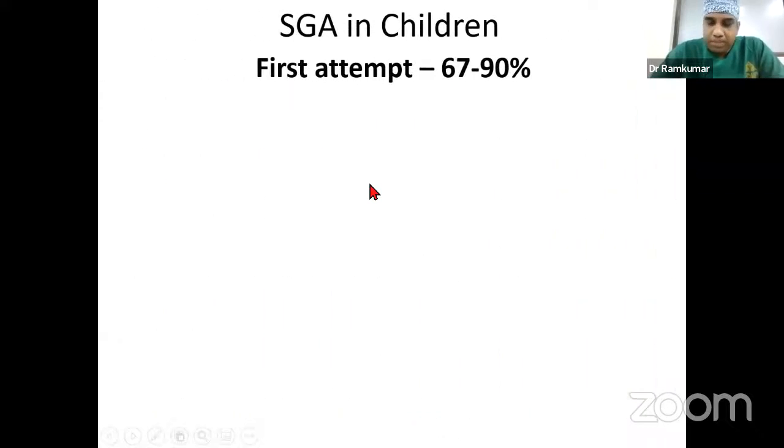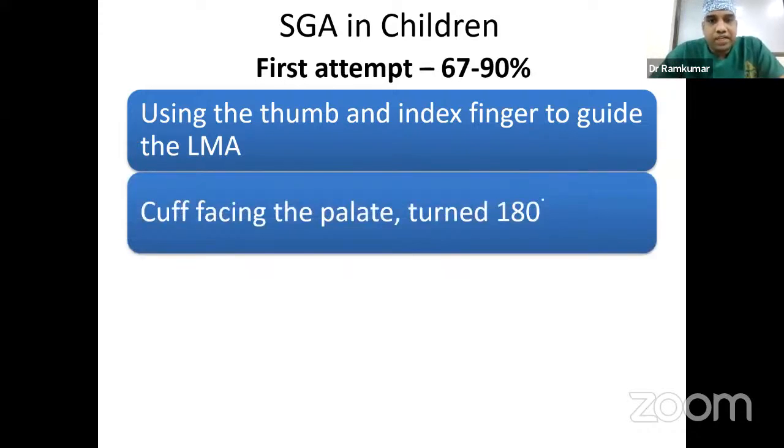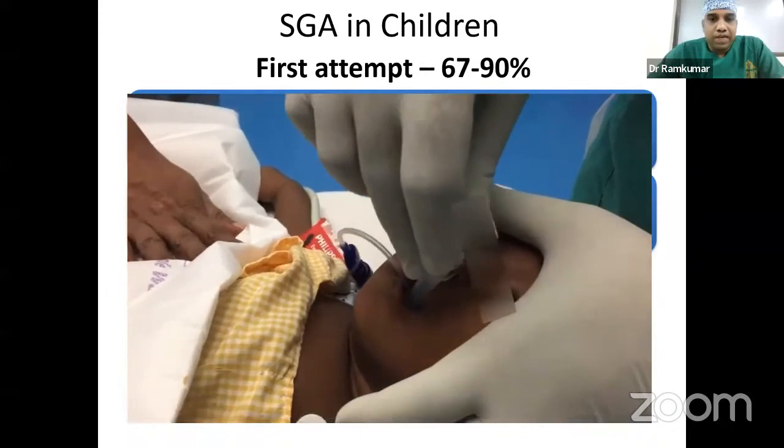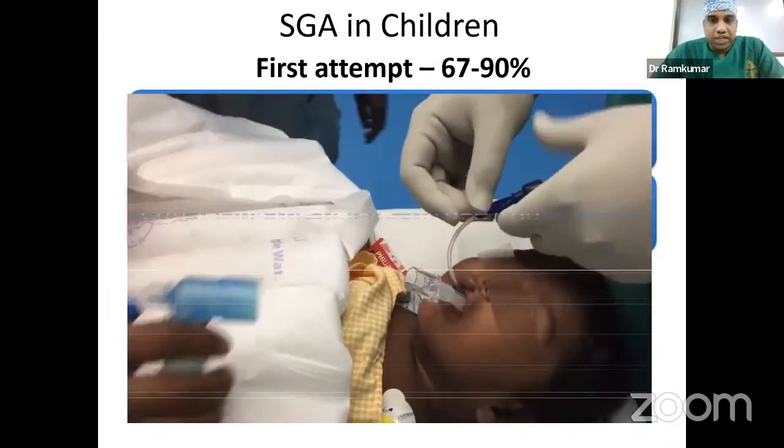Coming to use of the device in pediatric populations, generally the success rate in pediatric populations varies around 67 to 90%. The techniques are the digital insertion technique, which I showed already. The other technique is needed because the problem with pediatric ventilation is that the tongue tends to move backward, and there is a chance of difficulty in placing, or a chance of tongue injury or tongue swelling. To avoid such problems, you can do a 180-degree technique like this. The cuff is turned 180 degrees towards the palate. Once it enters the pharynx, you can turn it and place it in position. This is called a 180-degree technique.